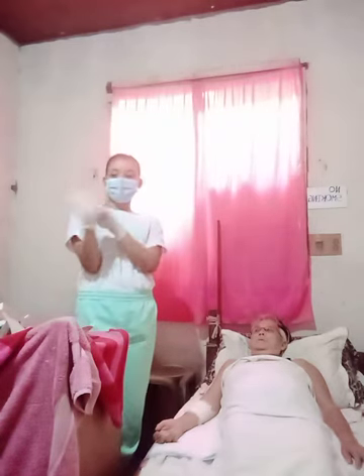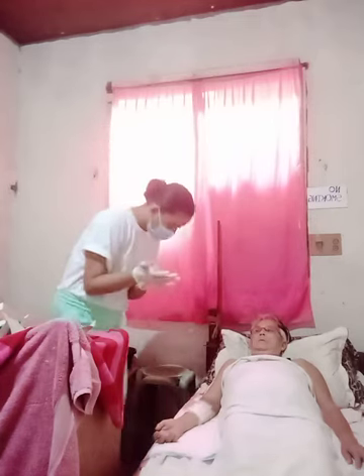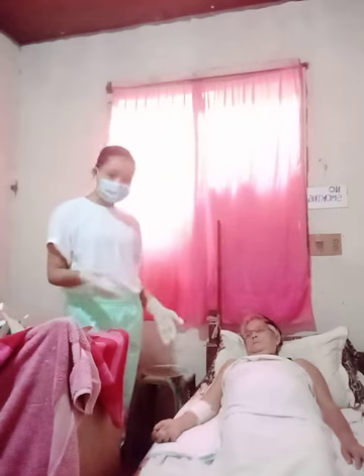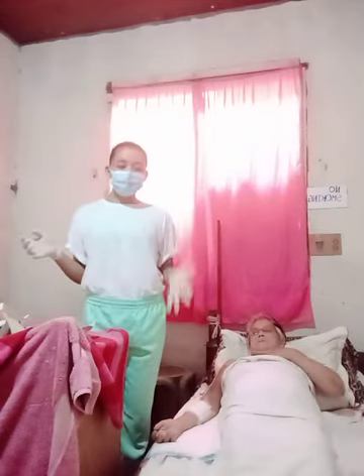Then inspect the wound for appearance, the character of the drainage, and the type of suture and drains. Then cleanse the wound with prescribed antiseptic solution or normal saline, and clean the wound from the least to most contaminated area.